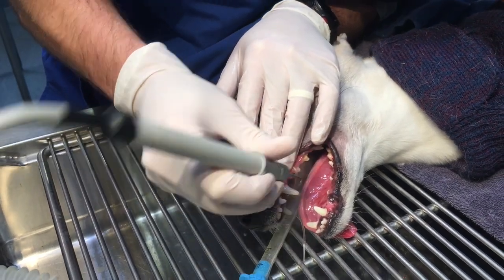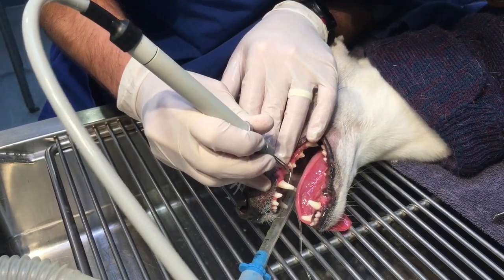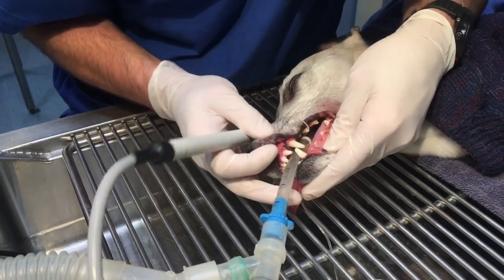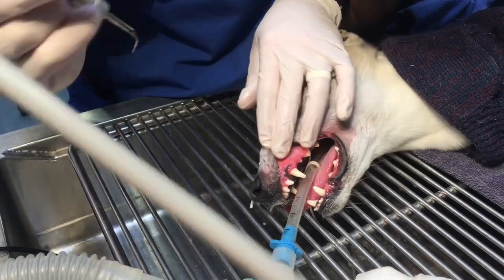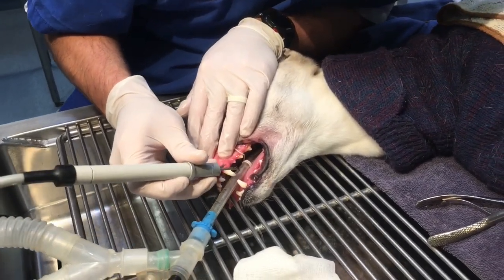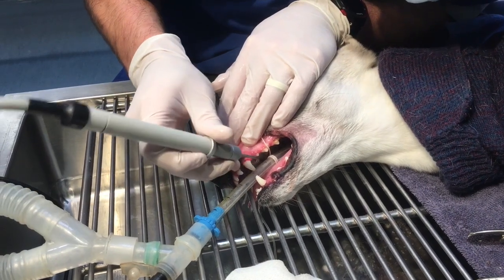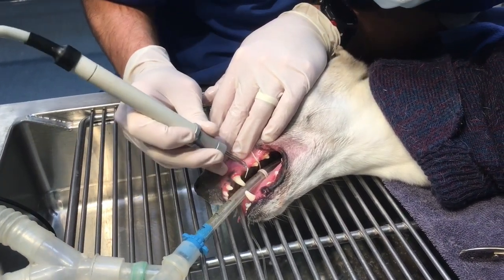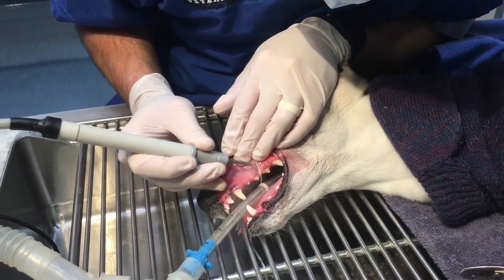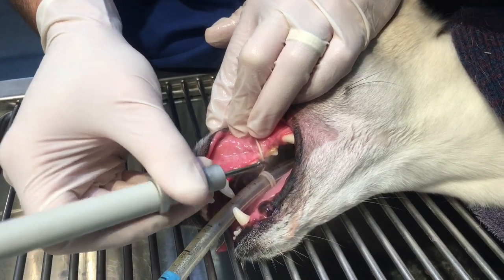Rosie has got a bit of recession on the back of her canine here — she's lost a little bit of the enamel, the nice shiny white stuff on the outside. There's a little bit of goo and debris there. It doesn't look like it's coming from any of her teeth, so maybe that's something she's getting from grabbing things around the house — kids' toys, maybe footy cards. We sometimes see this if they chew at the gates due to a bit of separation anxiety.